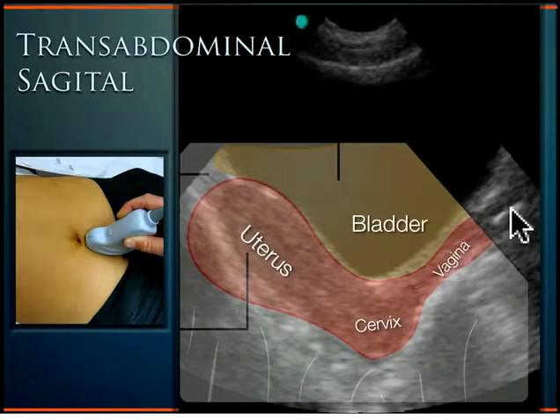We see the vaginal stripe seen here, terminates at the cervix, and the uterus is stretching out here, posterior to the bladder. So this is the anterior cul-de-sac, the fundus of the uterus is here, and this is the posterior cul-de-sac back here.